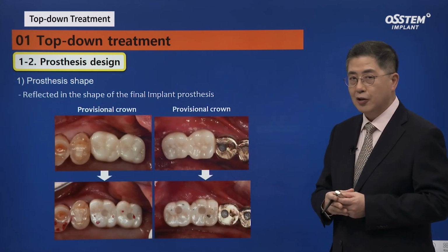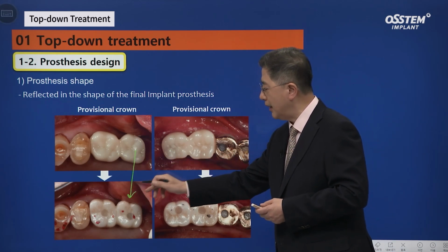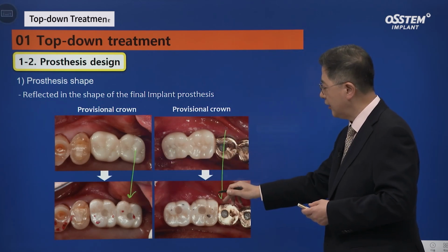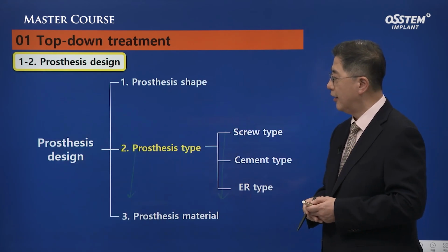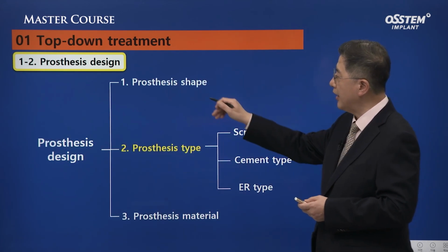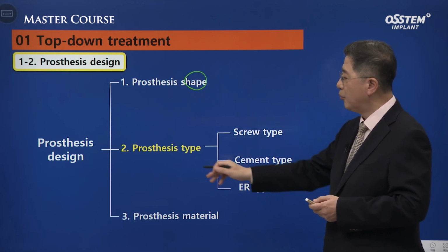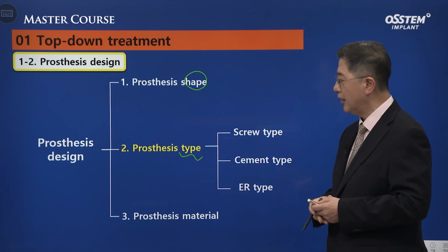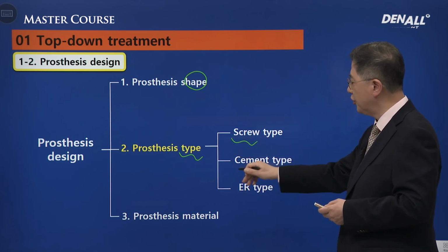We need to set first using provisionals and then find the right form of prosthesis. After making adjustments, we need to make the final prosthesis. That is the reason why we use provisional restorations for a certain period of time. We consider different factors to adjust the prosthesis.